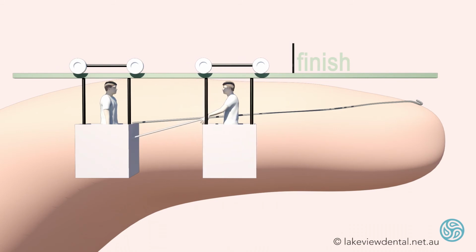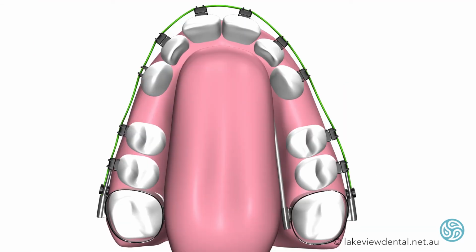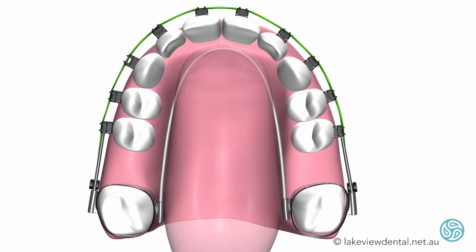This is to illustrate the equal but opposite effect and applies to the wire that is on the outside of the teeth as well. With the application of power chain, elastic bands, the teeth will be pulled forward, but there will also be a resultant backward force. Without the use of stop locks and the FRLA, loss of arch development would result. This would then result in back teeth moving forward, but also the front teeth moving back and meeting somewhere in the middle, which is undesirable.